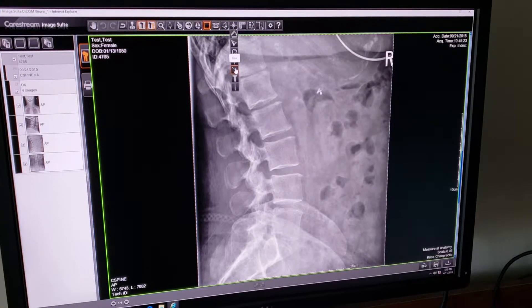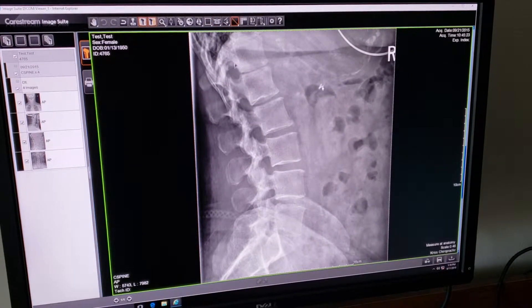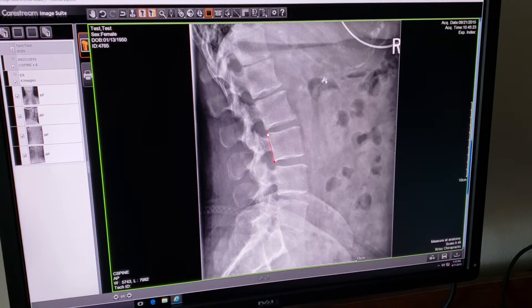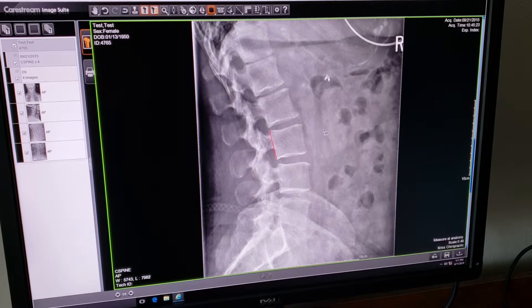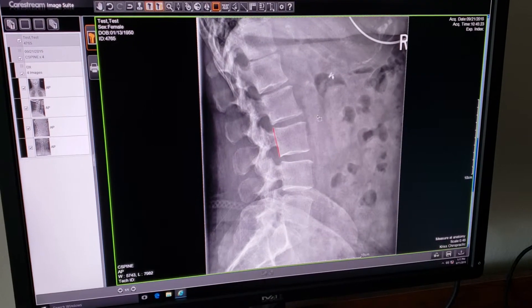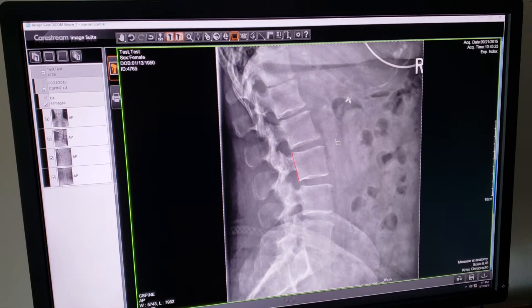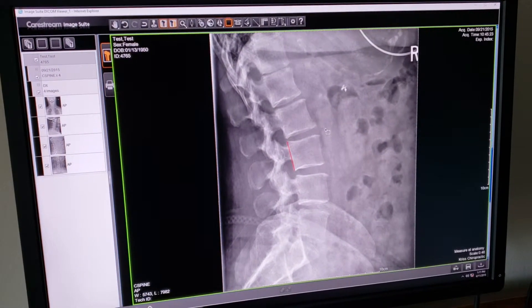The next tool in this bar is a line, just a simple line segment. I'm going to left click, hold, drag, and there's our line segment. I will use this tool in conjunction with another one in a few minutes in order to show you how to grade antero or retro-listhesis.